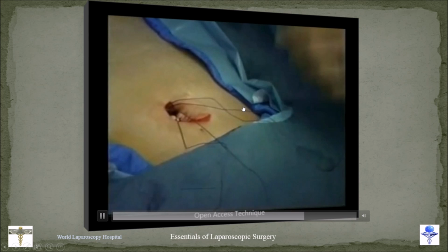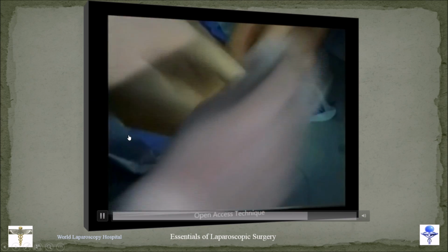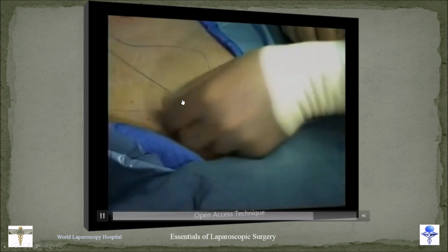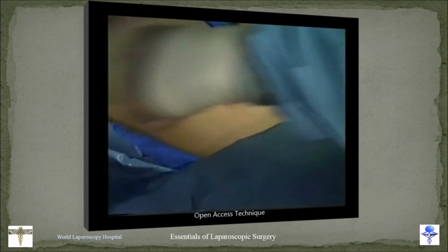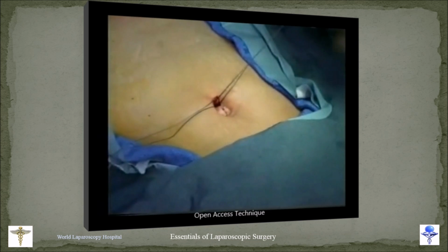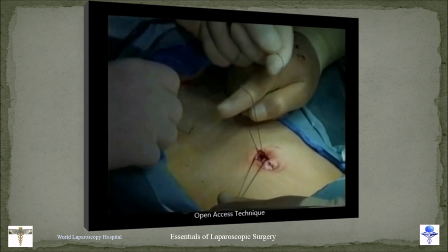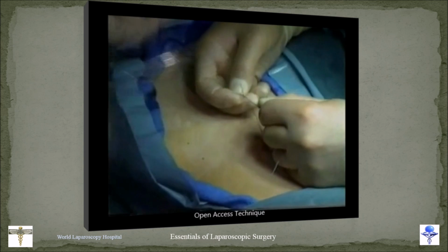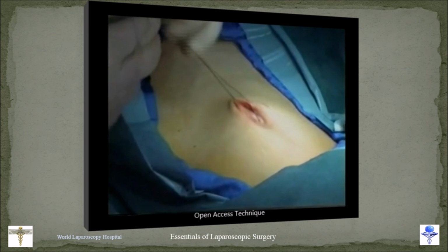So, at the end, the same suture which was taken to stabilize will be used to close the wound, but what you do, you cross it. Right will go to the left, left will go to the right, and then tie a tumble square knot. This technique we will learn also in the lab. This is called a tumble square knot, and it is crossed. Right is going left, left is going right, and this is a tumble square knot which can slide directly. Now, it is tumbled and you cut it, and now it will slide on its own, and then you can pull it.